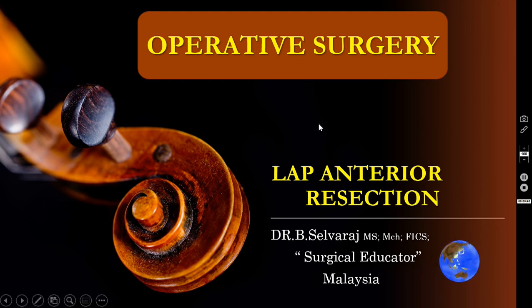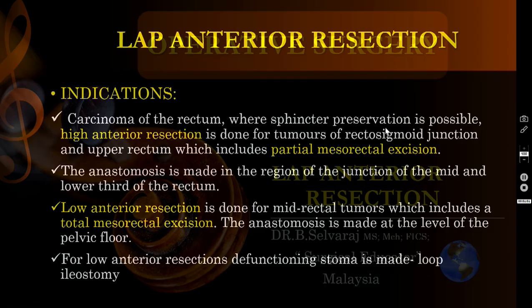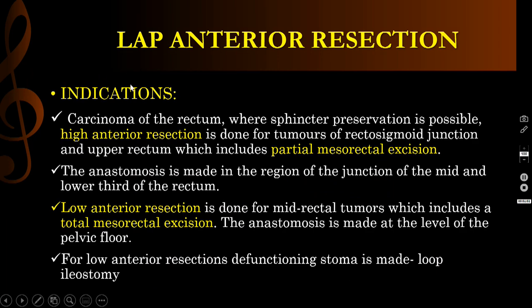Today, in this episode, I am going to discuss one more operative surgery procedure: laparoscopic anterior resection. So, what are the indications for laparoscopic anterior resection? Indications are, of course, the same as for open anterior resection.